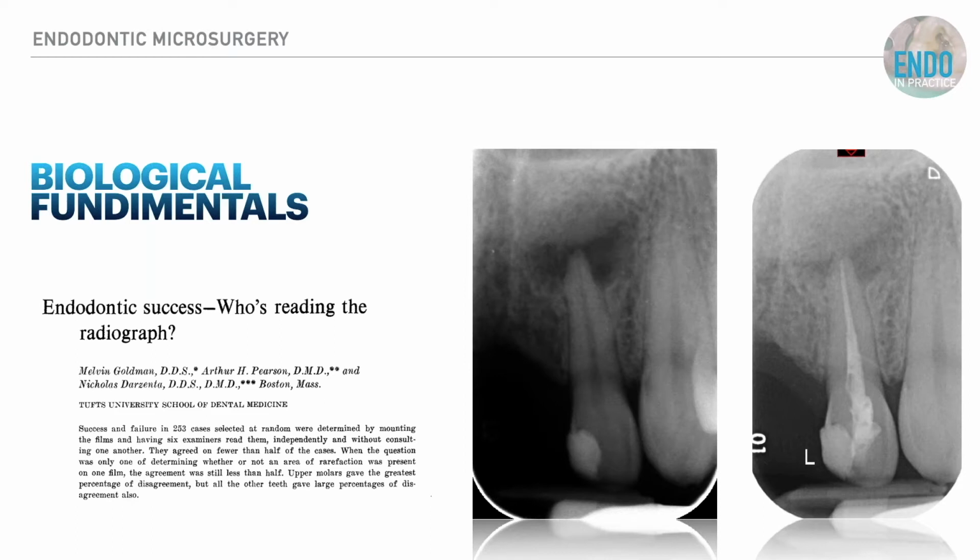And coming back to that internal bias, when we look at radiographs and we look at radiolucencies, we all get into the way of saying, oh, that's pathology. Well, from a radiograph, you can't technically call it pathology. All you can say is that it's a radiolucency.